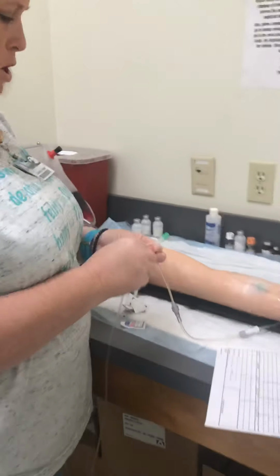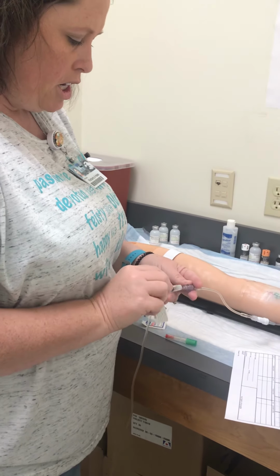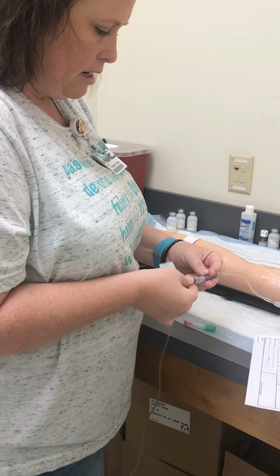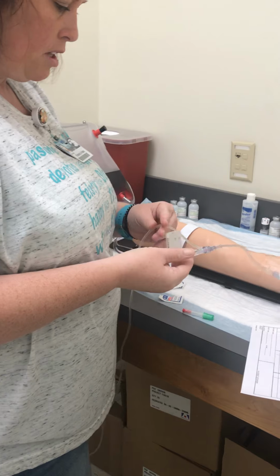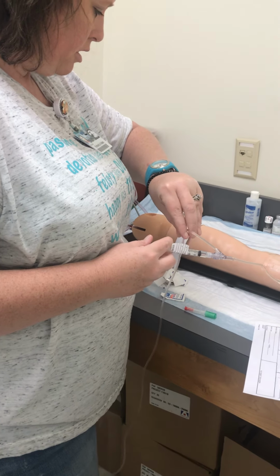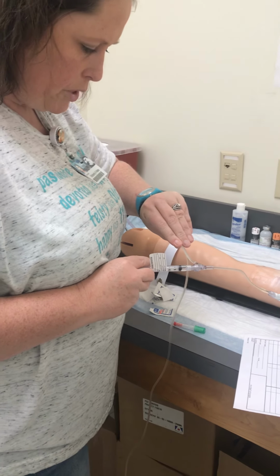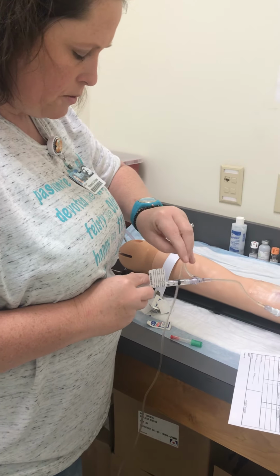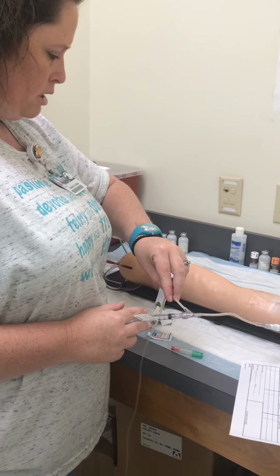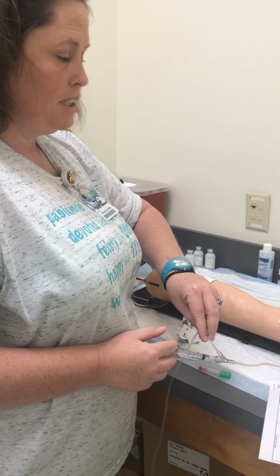While we're giving it to him, we're going to watch for his respiratory rate. Okay. I'm going to give him 0.1. I'm going to release. I'm going to wait a minute to monitor for any signs and symptoms.